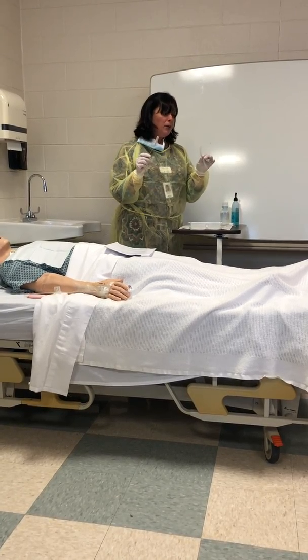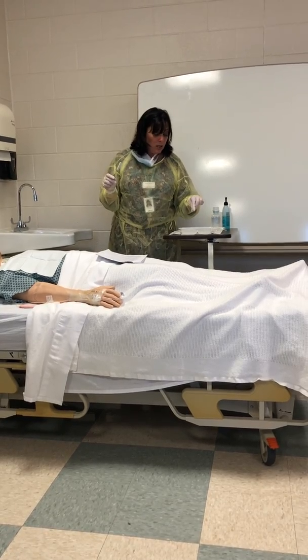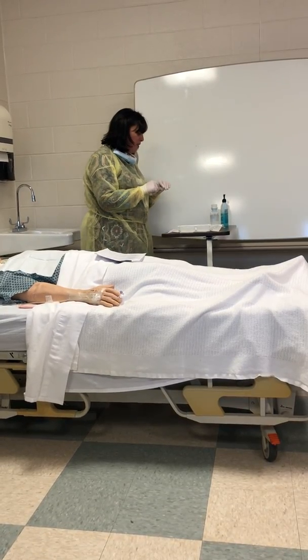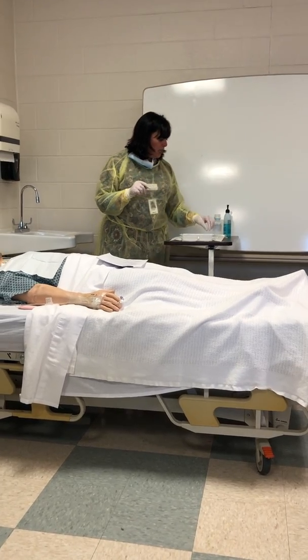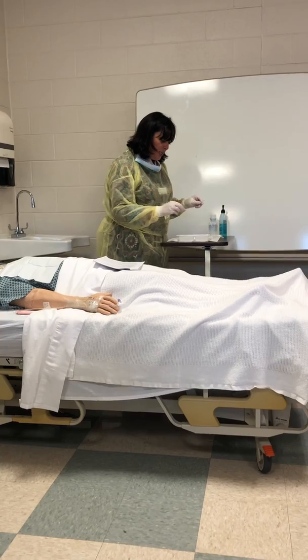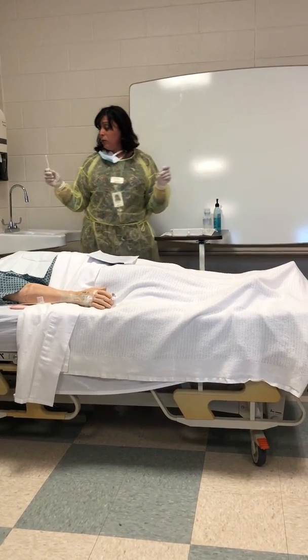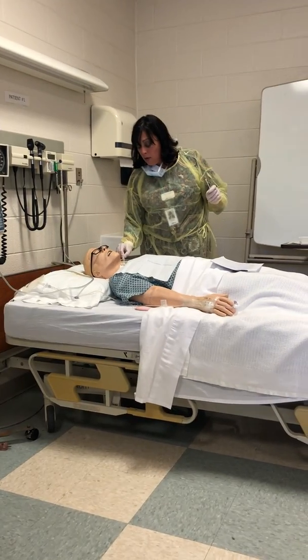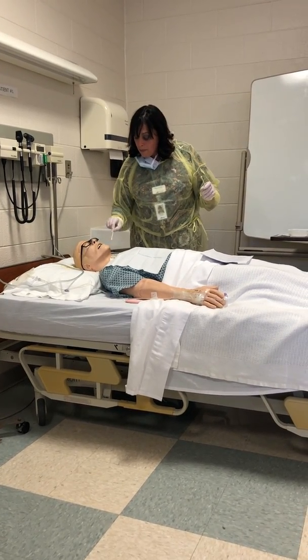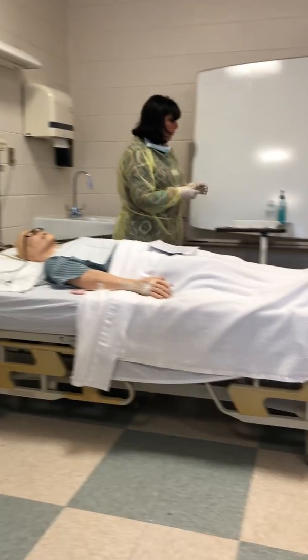Okay, so I think I got him nice and clean. I got all the funk out. So I'm gonna drop it down into the sterile water, or whatever my facility states. And while he's sitting in there cleaning off, I'm gonna take these little guys. You can put it in the peroxide, you can put it in the saline, whatever you wanna do. I'm gonna clean the faceplate off. It got bubbly, so I'm gonna do it with the saline. Okay, let's drop those.